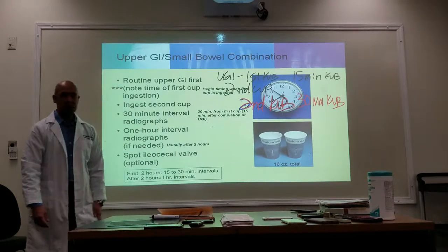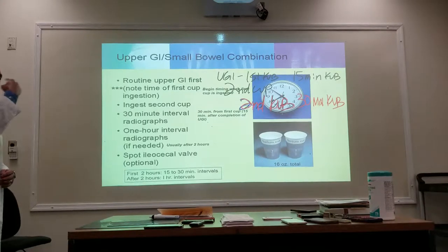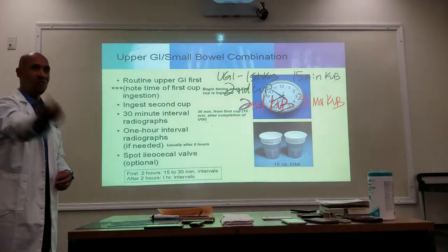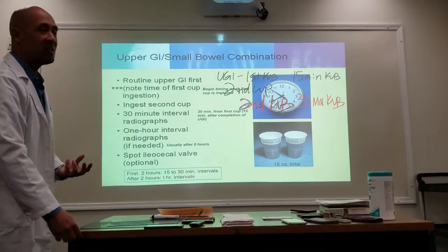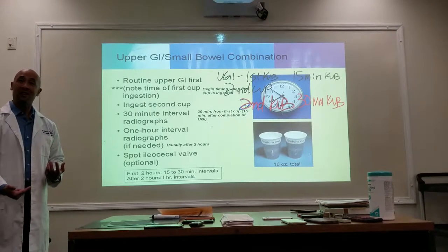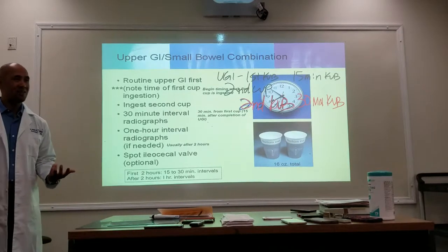After the second hour, then you do 1 hour intervals, okay? And again, we do these KUBs over and over and over again until the entire small bowel fills up. Well, how do we know if the entire small bowel has filled up? You see it on the x-ray. You're going to start seeing the large bowel. That's how you know you've got there.